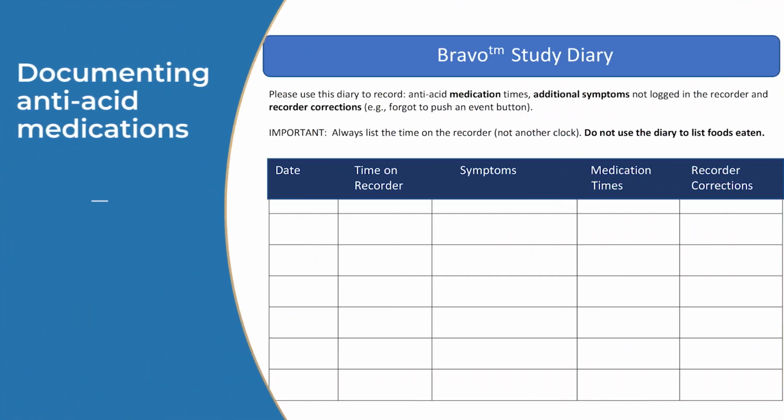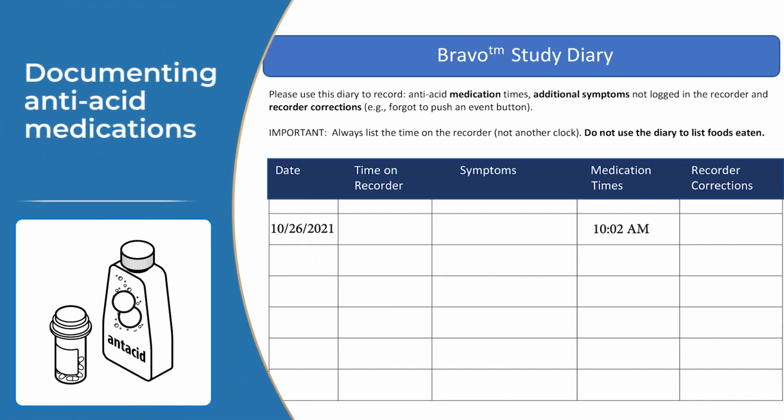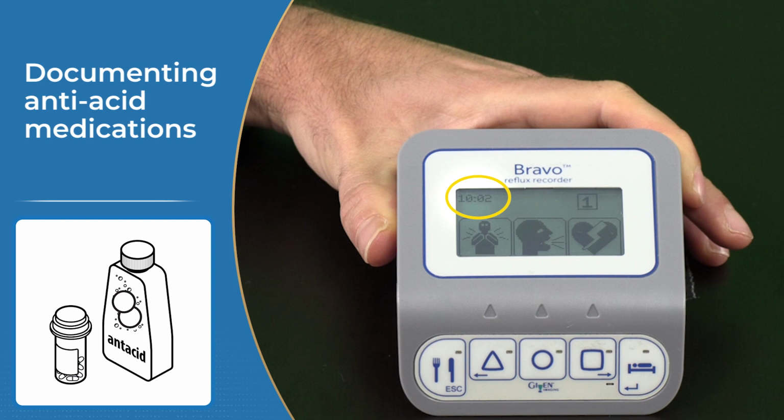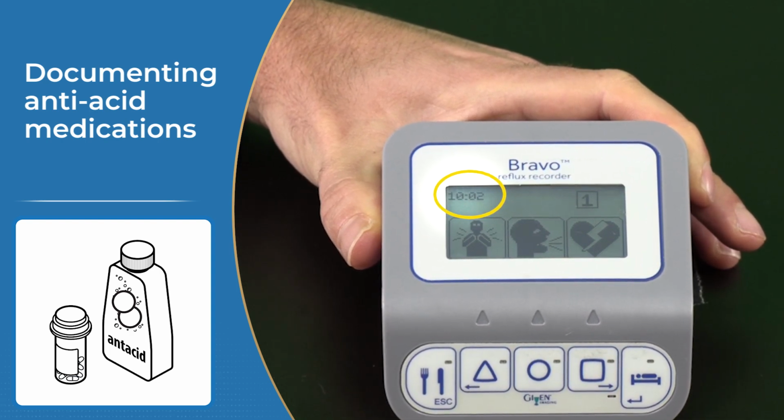If your doctor has instructed you to continue taking antacid medication during your Bravo procedure, you'll use the diary to document the date and time you took the medication. Use the time that appears in the upper left corner of the recorder. It is important you do not use any other clock.